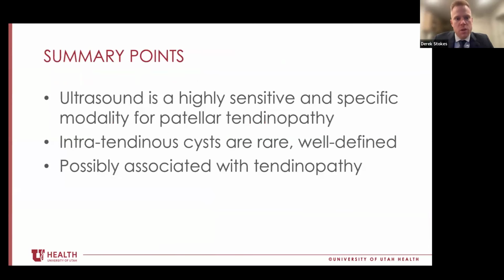So for the summary points of this presentation, ultrasound is a very highly sensitive and specific modality for patellar tendinopathy. And intra-tendinous cysts are actually quite rare, but very well-defined structures that you can see pretty easily with ultrasound. They may possibly be associated with some sort of pathology, such as a tendinopathic process, but they're so rare, we have such limited information on it that we don't actually know exactly why or how they form.